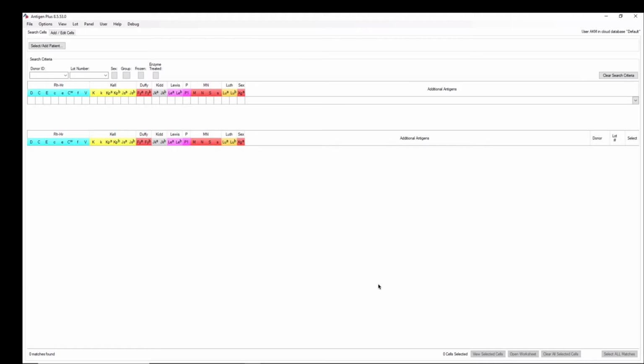With that and the reading materials, we really don't get any calls from techs to say how do I do this, how do I do that. We spend most of our fun time with the IT folks. So it's pretty intuitive for blood bankers, but there are some things that would be handy to know up front, so you don't have to fumble for everything in the user guide. I'm going to go through some real basic stuff, and then we'll get into a little bit of how you might approach a case.